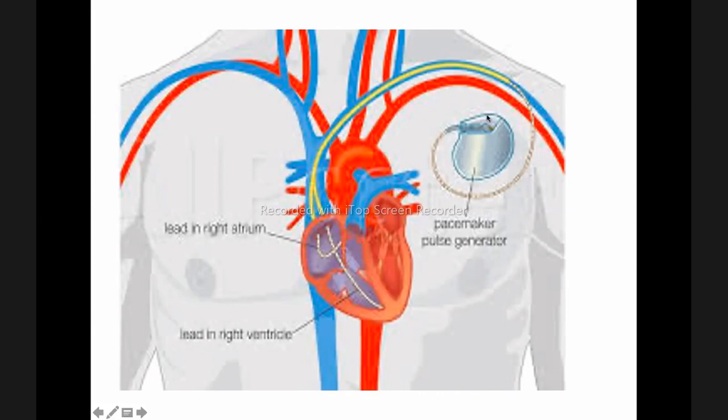With the newer pacemakers, if a patient has a fever where you need a higher heart rate, or if the patient is exercising, decides to go for a jog, or is climbing upstairs, or any condition that requires the heart rate to increase physiologically, then it's able to sense that. It's got what we call rate responsiveness. It's able to sense those activities and increase the heart rate. So the patient remains very comfortable because this has taken over the pace, the conduction system of your heart. Okay? I hope that's clear. That's generally, as simply as I can put it, the role of pacemakers and pacing.